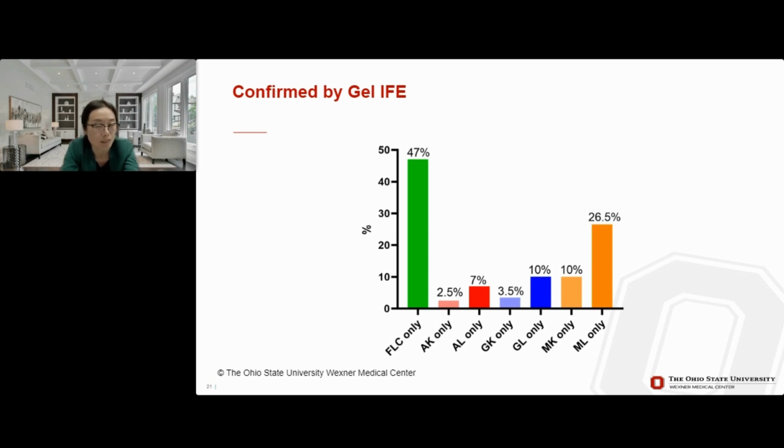gel, which makes sense because capillary does not have IgD or IgE antisera available, and we need to run IgD or IgE on gel to exclude the heavy chains of D or E when we find the free light chain only on capillary. Following free light chain cases, IgM lambda was the most frequent one for gel confirmation. The question is why we have that many IgM lambda running on gel for confirmation.